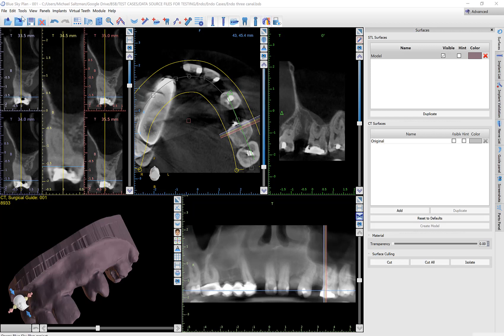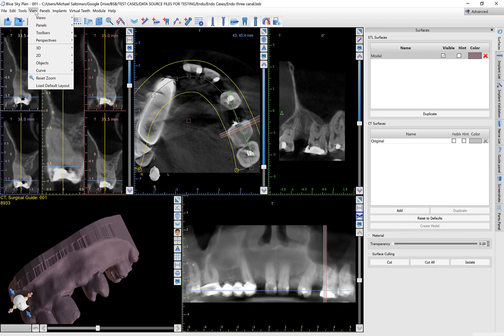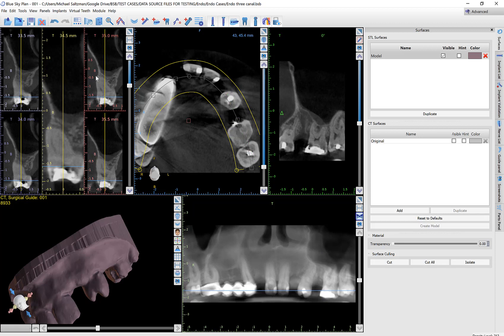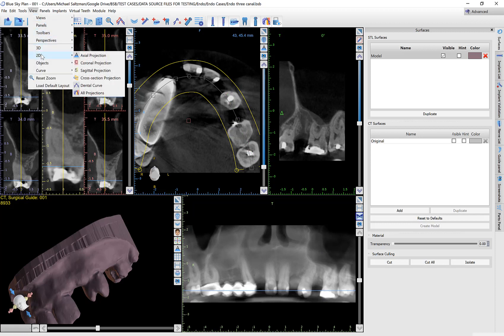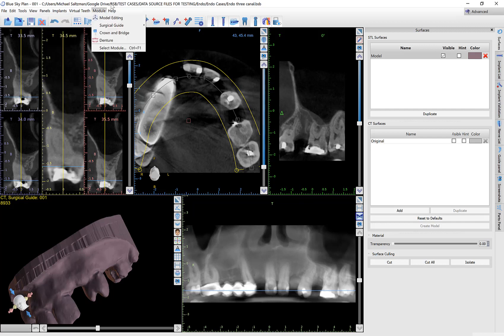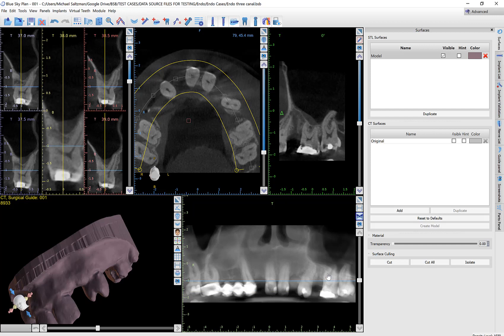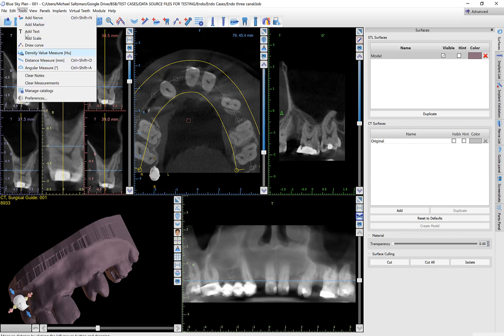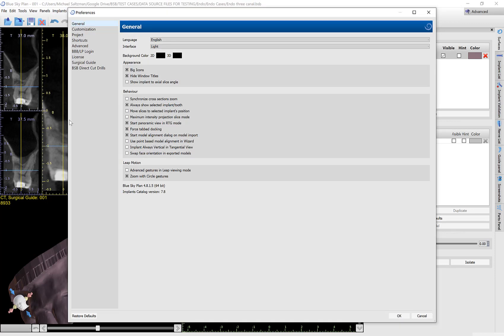A couple of settings I think will make the process easier: first of all, turn off the cross-section projections because they kind of block what we're trying to see. I did that by going to View > 2D > Cross-Section Projection and clicking on that to remove the multicolor lines representing the cross-section. In addition, I recommend going to Tools > Preferences and unchecking the checkbox 'Move slices to selected implant's position.' When it's checked, clicking on an implant causes all views to jump and update to show the implant in the center — usually helpful, but in our situation we don't want the slices jumping, so I'm turning that off.